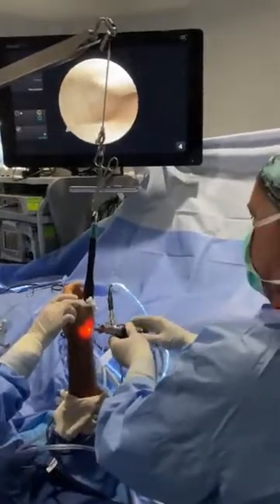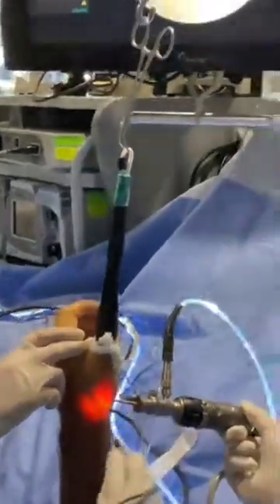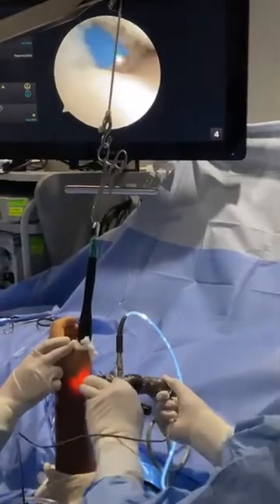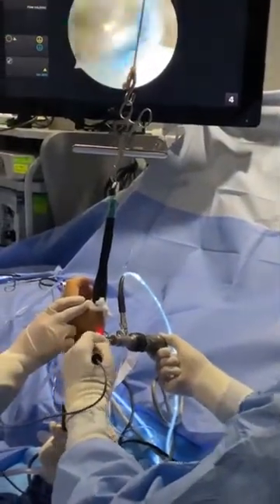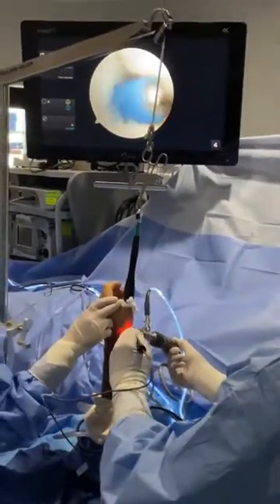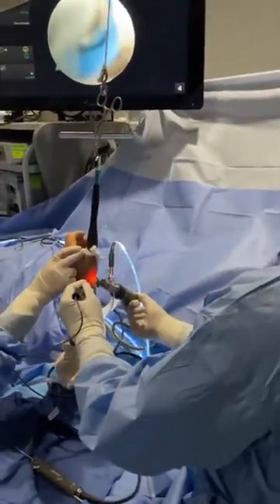This already looks better — you can see more transillumination. When we first got in there you only saw a little bit of orange, but now the whole joint is lit up because I removed the inflamed lining. This is technology we kind of steal from the knee guys, because it's a big joint and a lot of industry in orthopedics is initially directed at knee problems because they're very common. I actually helped design these probes over 20 years ago — don't ask me if I got any royalties.